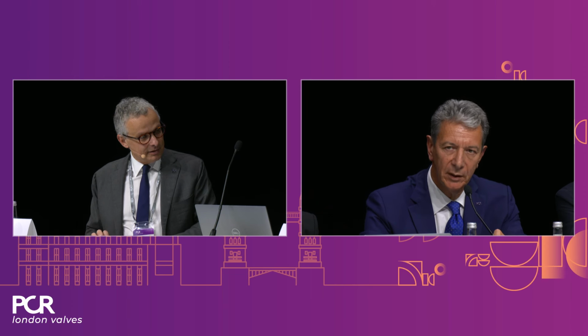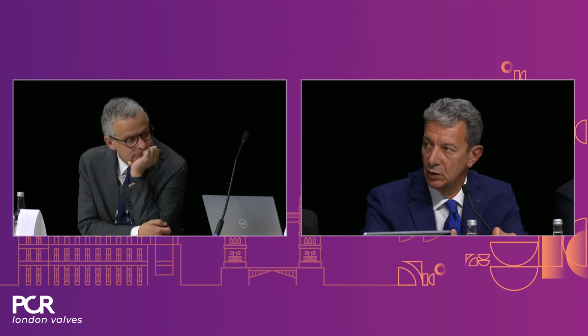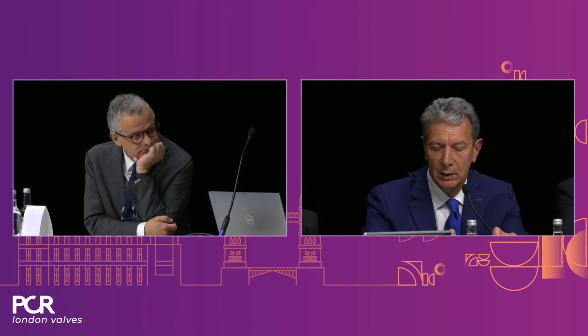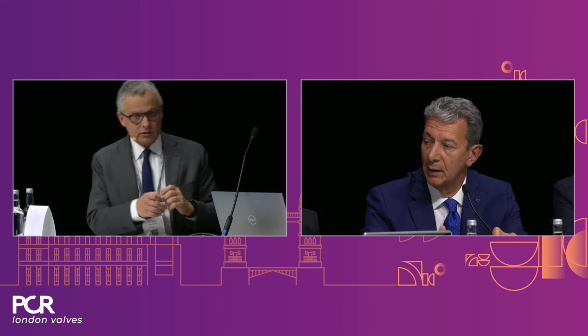Francisco, I think that we have to see the question from a different perspective. I think that we need a dedicated imager for this kind of procedure. When we decided to change from the interventional cardiologist to the imager for the catheter management, the quality of the images changed completely. The imaging in general, if it's managed by the imager, is extremely better.